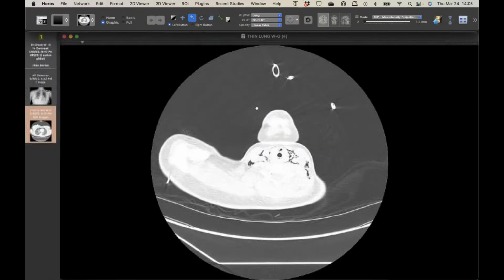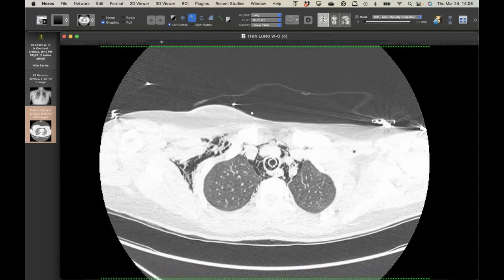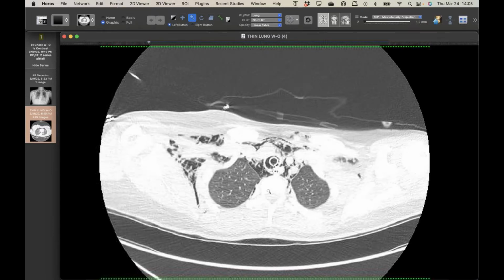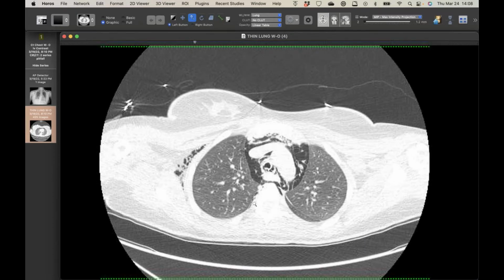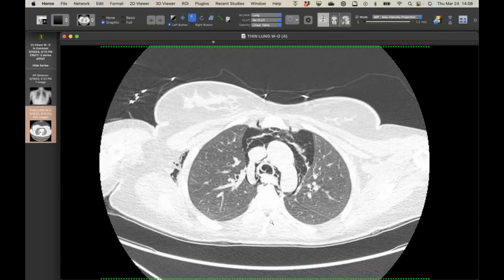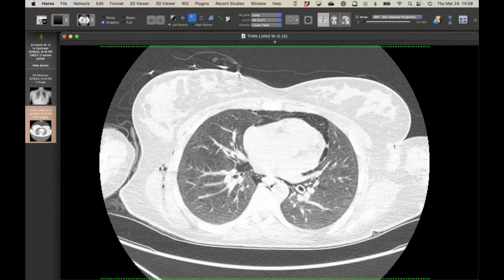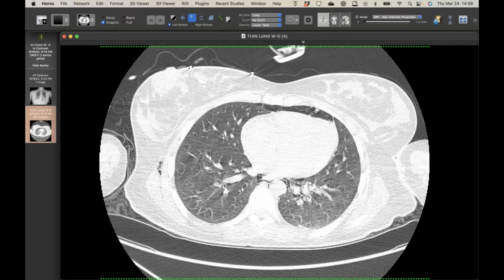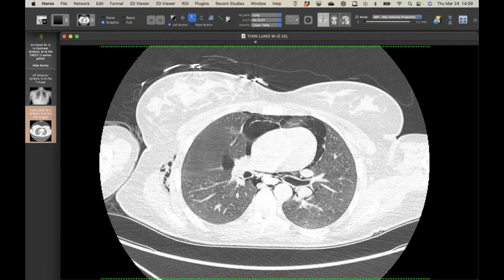But they got a CT later on for a different reason, which I think they were looking for the source. You can see, indeed, there is no pneumothorax, at least not convincing. I think this is all pseudopneumothorax here. And then you can see really nice interstitial gas. This is one of the better ones I've seen in a while. A nice example of the Macklin effect with interstitial gas. It's on both sides. You can see ring around the arteries and all that. So unclear exactly why this happened. I don't think the patient was asthmatic, and I don't think they got the whole story. She was intubated. I believe she was altered, so she may have been on drugs or something.